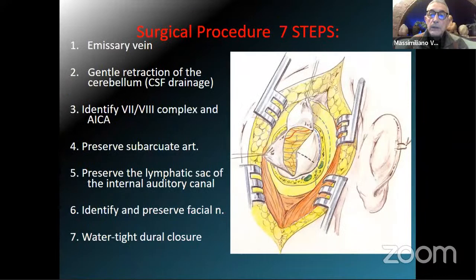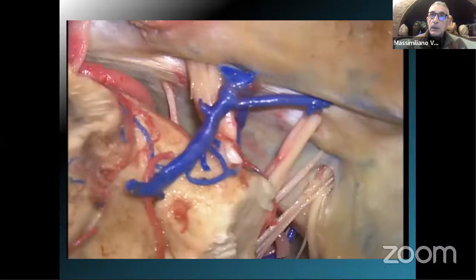And we can open the dura in different manners, like Y shape, or also linear or semi-linear shape, in order to better tailor both opening and closure of the wound and avoid as much as possible postoperative CSF leakage.